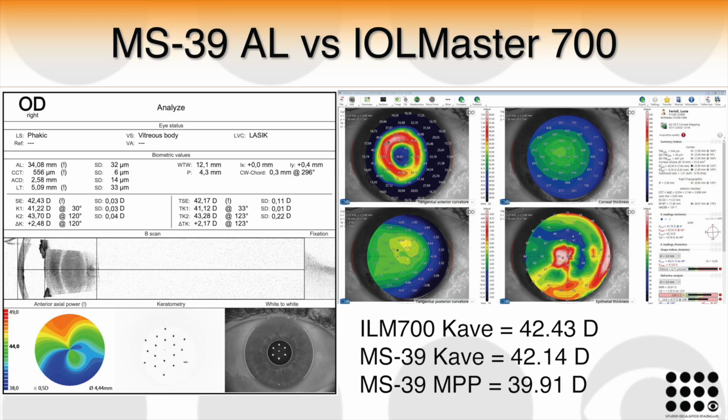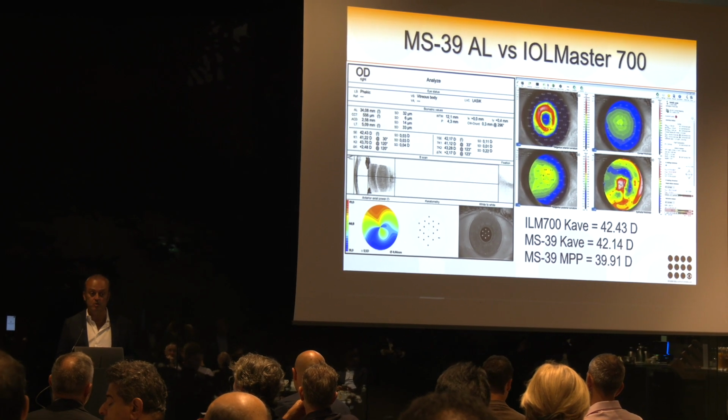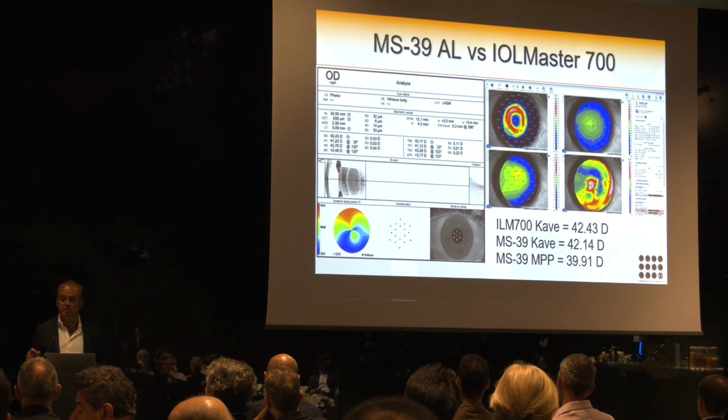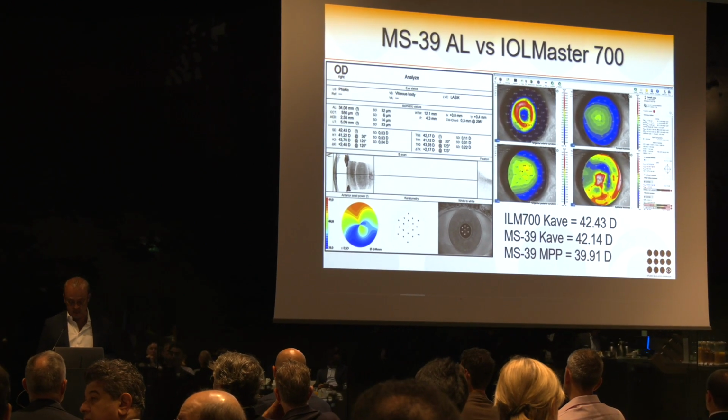It means that it's not a problem of converting the anterior radius into corneal power with the keratometric index. Of course, there's also this error. But when the optical zone is so small, of course, the main problem is that the instrument provides you a measurement of the anterior corneal curvature in the wrong place, in a place that is too large.